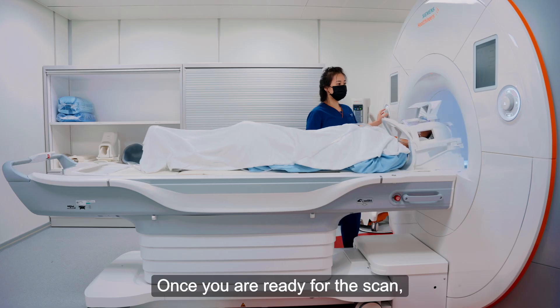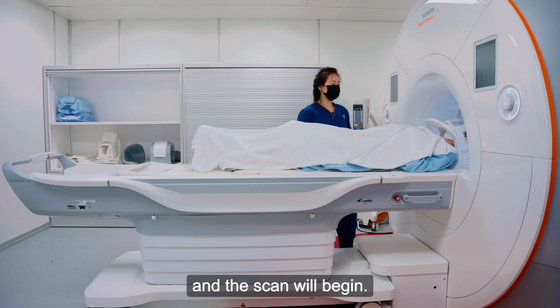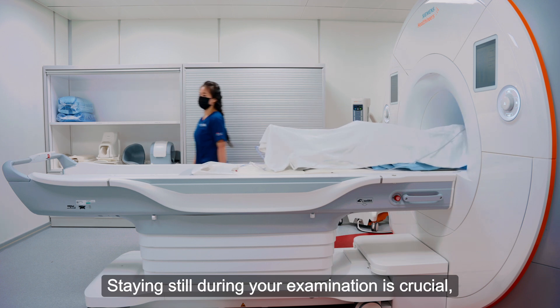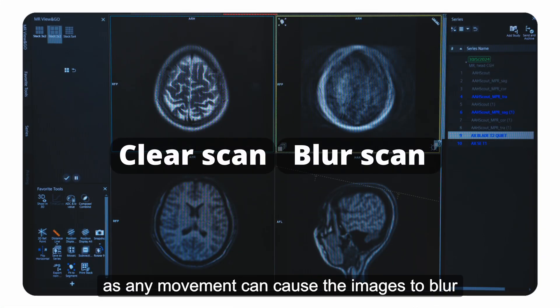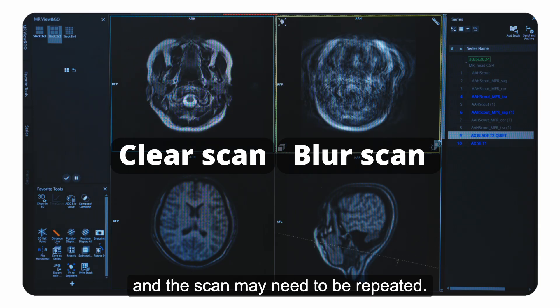Once you are ready for the scan, you will be moved into the MRI scanner and the scan will begin. Staying still during your examination is crucial, as any movement can cause the images to blur and the scan may need to be repeated.